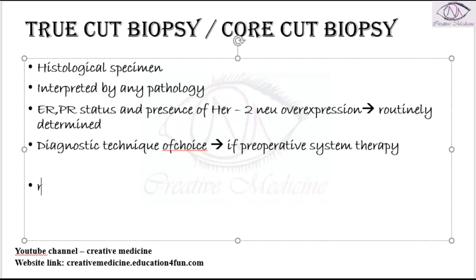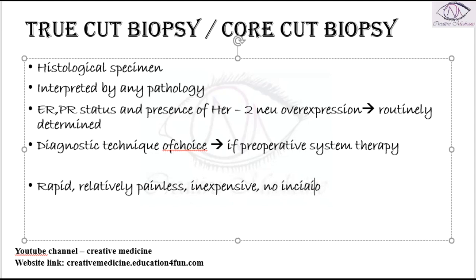This true cut or core cut biopsy is also rapid. It is also relatively painless. Then it is inexpensive, and here no incision is required.